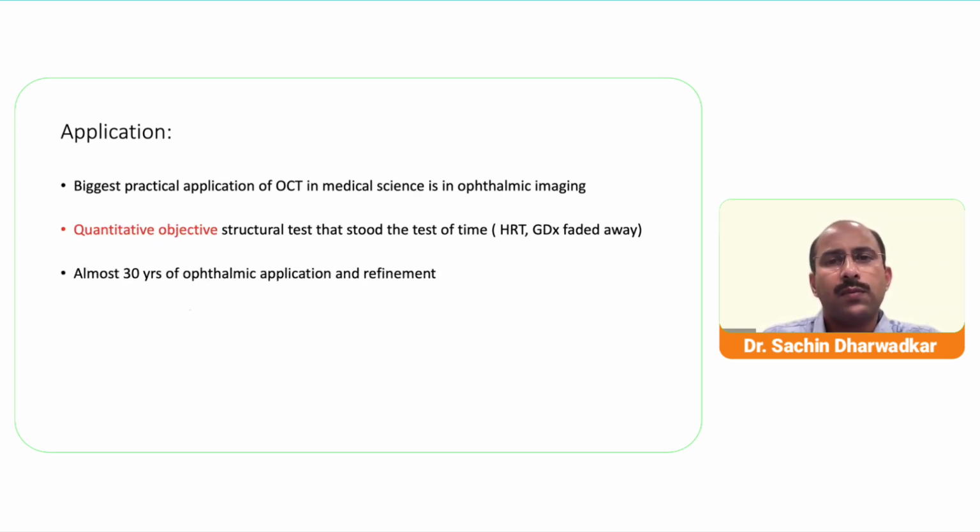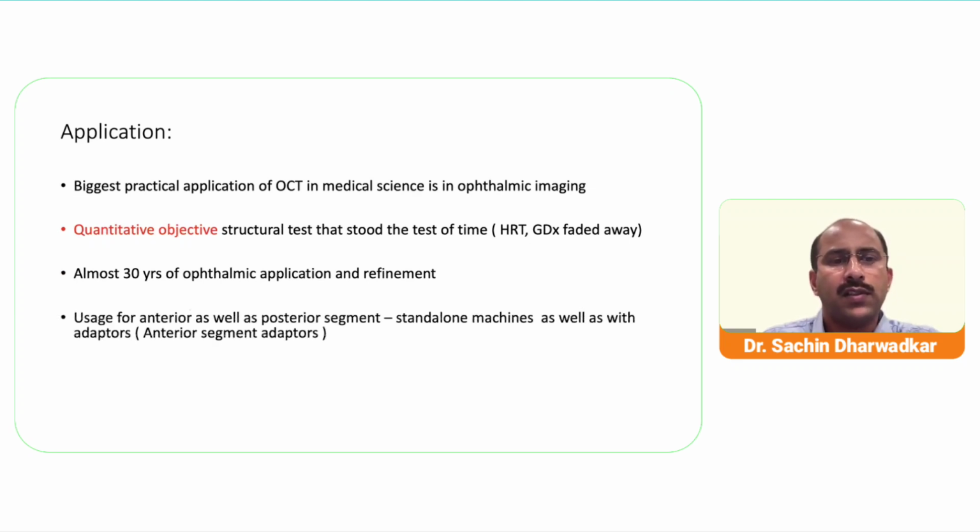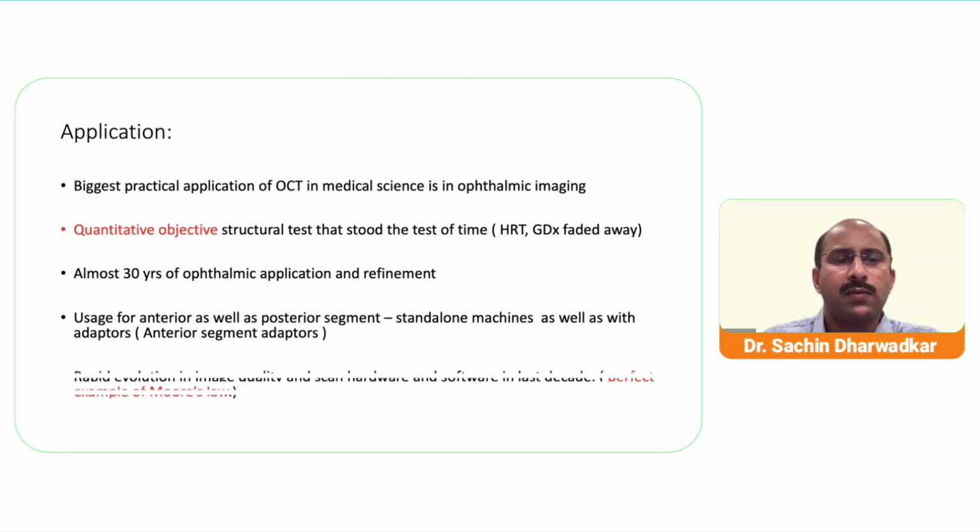Almost 30 years of ophthalmic application and refinement have gone behind the current OCT technology today. And there is usage of anterior as well as posterior segment machines, separate as well as standalone, as well as with adapters, to give you both the views of the anterior and posterior segment, though the dedicated machines do offer much more advantages over the combined machines.